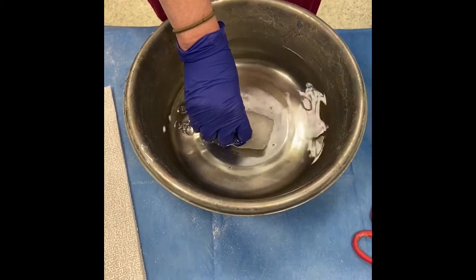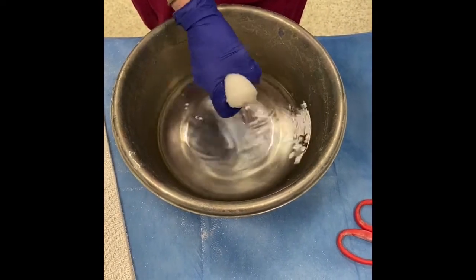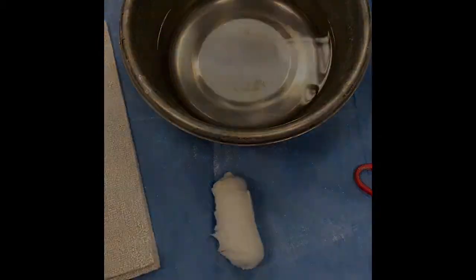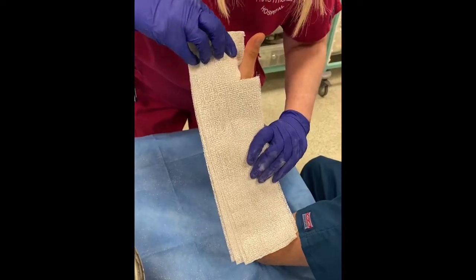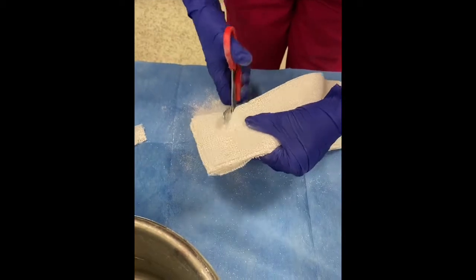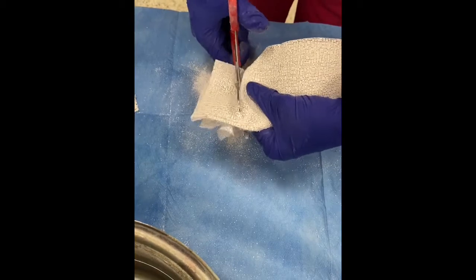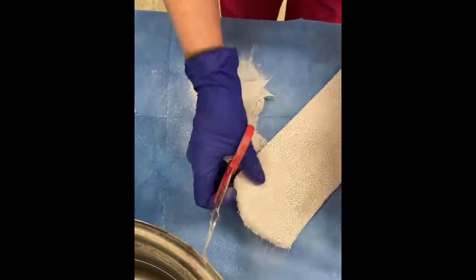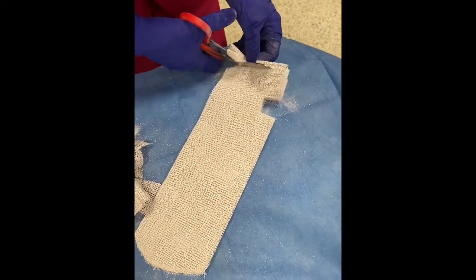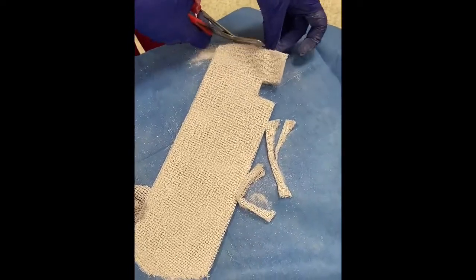Once the back slab has been applied it is held in place with a gauze bandage, and it's often easier to soak this first as it makes handling smoother. The back slab is then fitted to the forearm, measured, and final adjustments can be made to make sure that the fit is optimal. A slightly more advanced technique is to round the edges, as this will make it more comfortable later — both at the elbow end and around the hand where often the back slab ends up quite bulky at the knuckles.